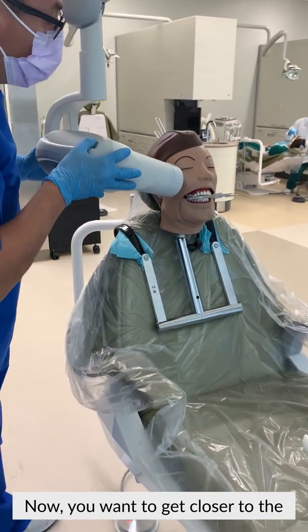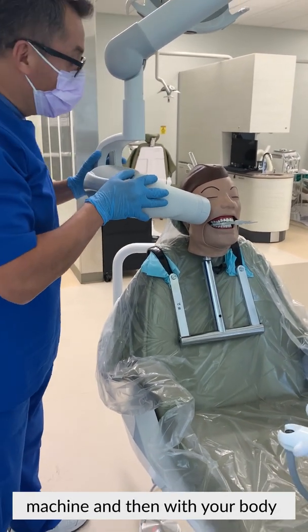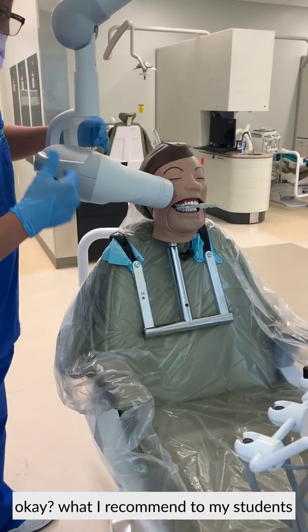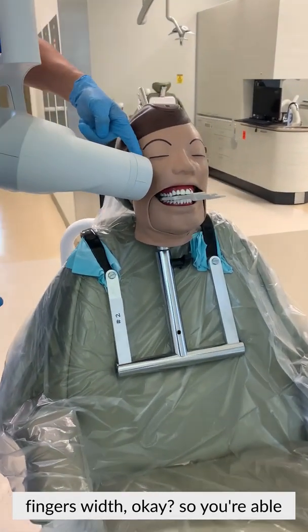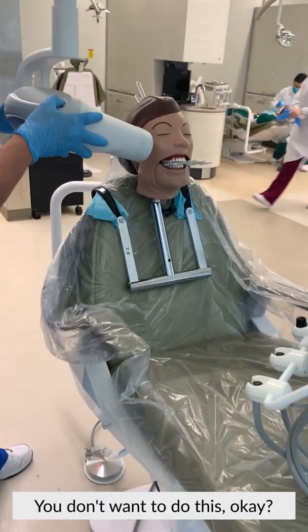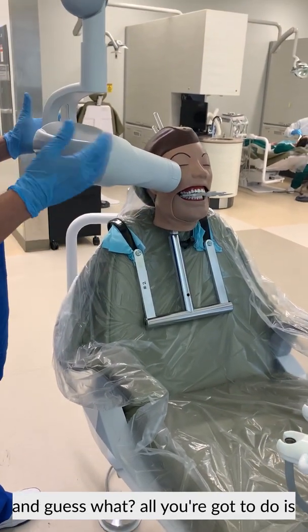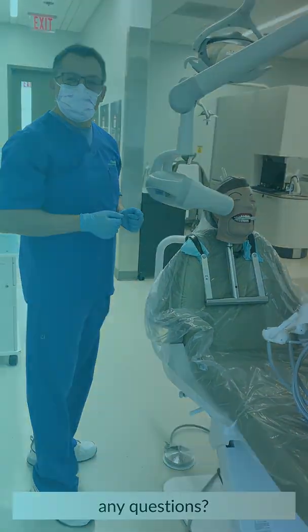Okay? Now you want to get closer to the patient. And again, always support the machine, and then with your body, you can just push the machine a little bit, ensuring that you don't hit the patient. What I recommend to my students normally is to leave a space about a finger's width. So if you're able to put your finger there, then you're good. You're close enough. All right? You don't want to do this. Come closer. Check the alignment here, check the alignment there. And guess what? All you're gonna do is just go there and take your x-rays. Any questions?